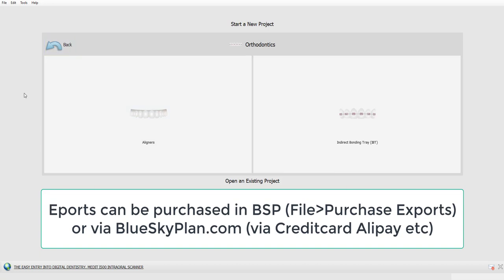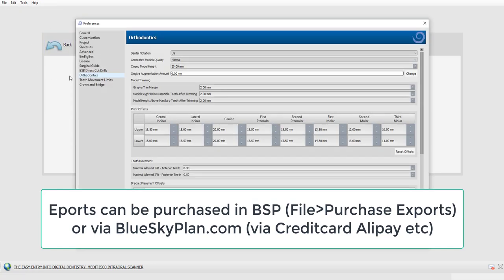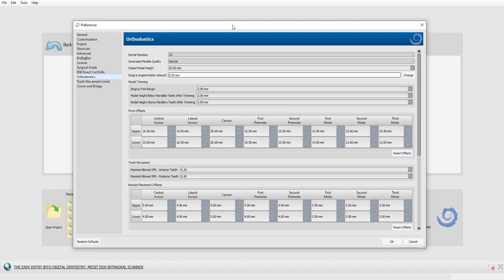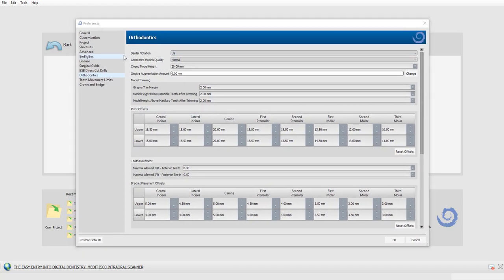With all the capabilities and automation we have in the software, we have preferences set up in the back of BlueSkyPlan. Understanding the different fields and their capabilities can help you design your models, aligners, and indirect bonding trays exactly the way you want them. It's perfectly fine to use the defaults, but the purpose of this video is so that if you do want to make changes, you can understand how to do so.